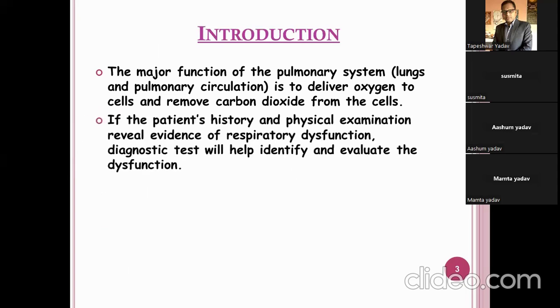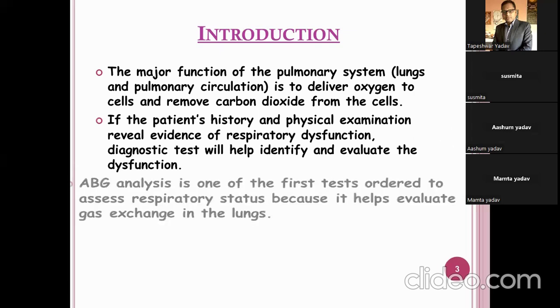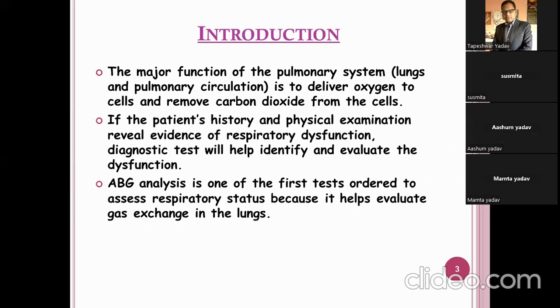If the patient history and physical examination reveal the evidence of respiratory dysfunctions, the diagnostic test will help identify and evaluate the dysfunctions. So what is the alteration there? For the sake of that, we are going to perform ABG analysis.